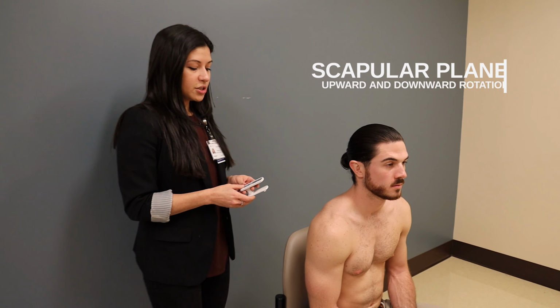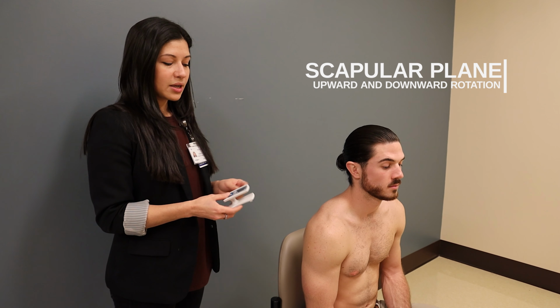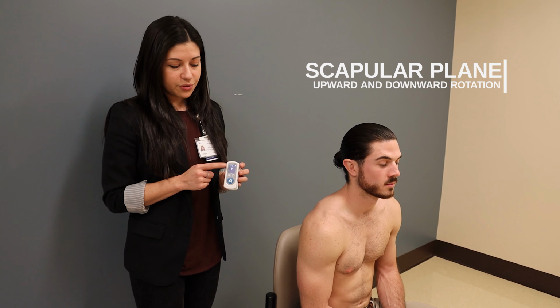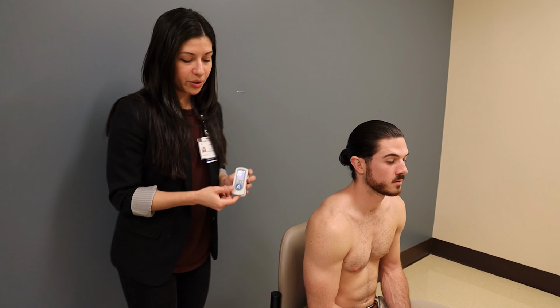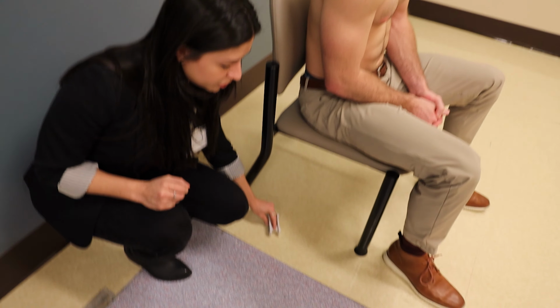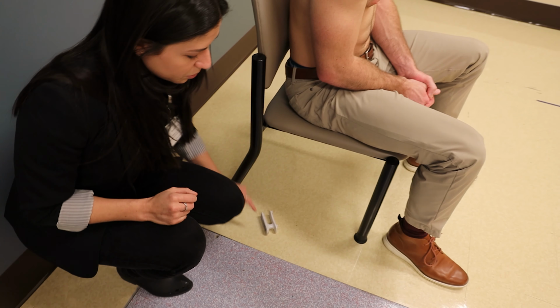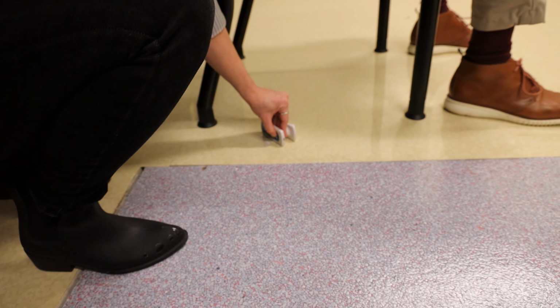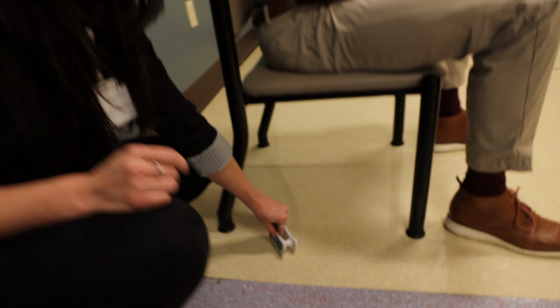So we'll start with scapular upward rotation. When we think of the scapular plane, we want to make sure that we're into 30 degrees when we're calibrating. So first make sure that the Easyangle is blinking. That means it's ready to calibrate. We're going to come down to the floor. And like I said, we want to make sure we're in about 30 degrees of the frontal plane. Then when we're ready, we'll hit the A button. And the A button is when you're calibrated and your 0 is set. So we hit it, it's set to 0.